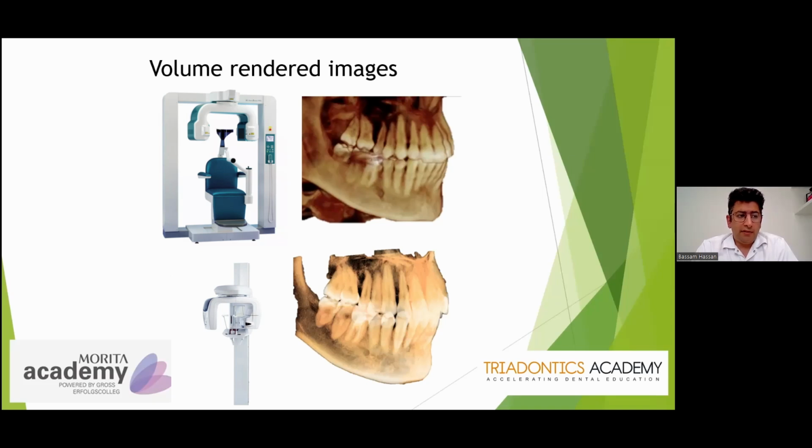The technology relies on rotation of an arm and an X-ray beam and a fixed kilovoltage and a host of technical factors, in which the image you're getting has reached more or less a stable resolution, stable image quality.